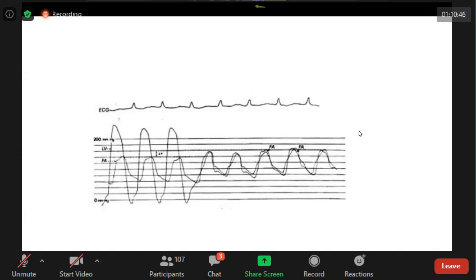during concurrent recording, there is a gradient between the left ventricle and aorta. Femoral artery to LV. A significant gradient is there, sir. I could not read the gradient. Is this the aorta or the femoral artery? Femoral artery, yes, sir. This is the left ventricle. At baseline, when you check the left ventricle to the femoral artery, there is a gradient. Yes, there is a significant gradient.